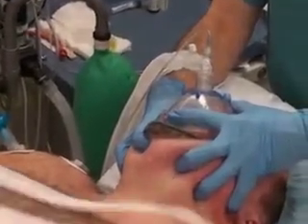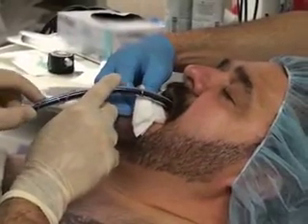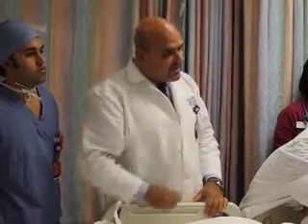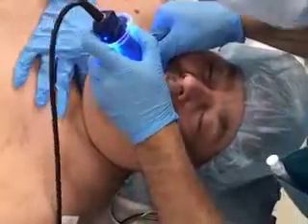When you have had difficulty in ventilating a patient through a face mask or intubating a patient, special consideration is required prior to extubation because the management of a failed extubation can be extremely challenging.